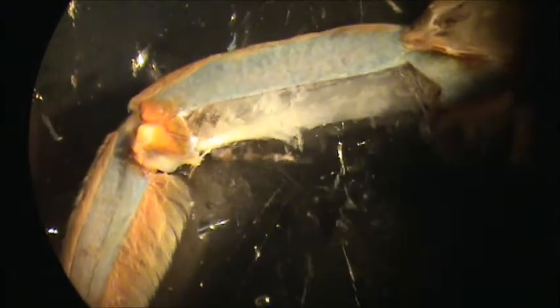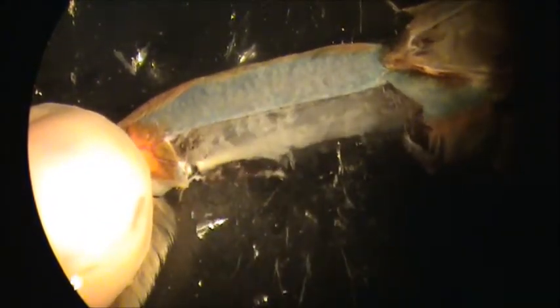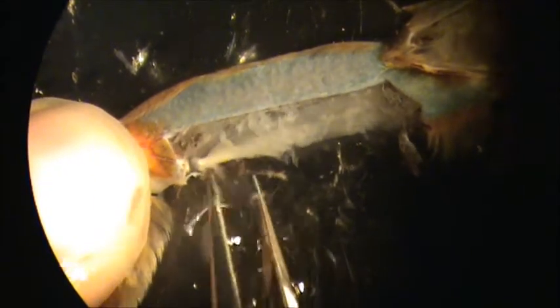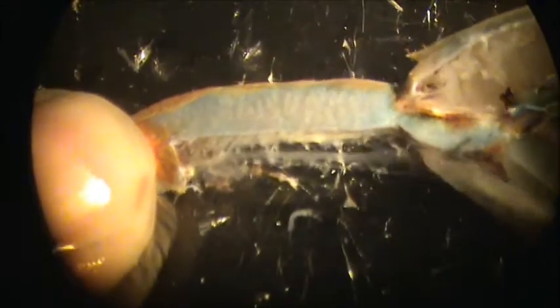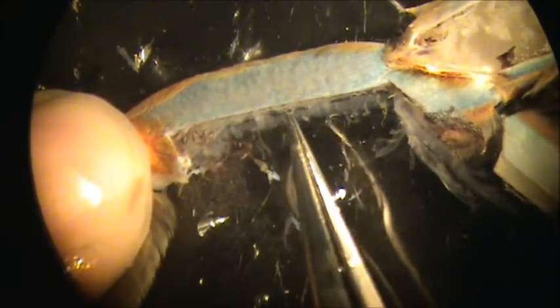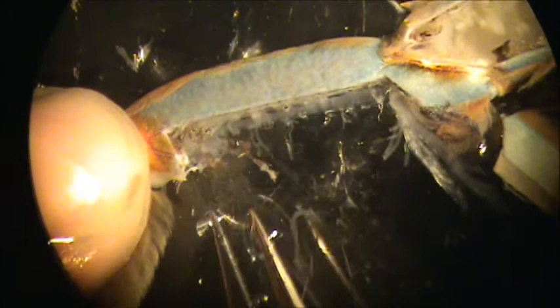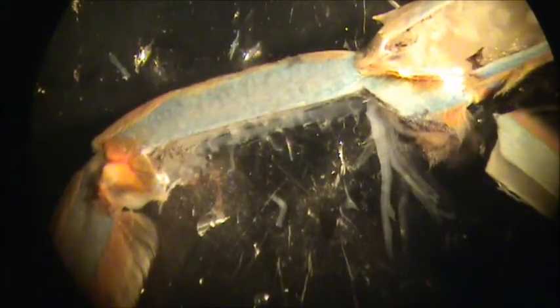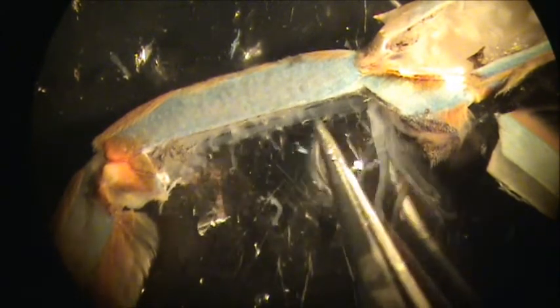Then now let's cut the tendon because we don't need it. And we can pull it back like this and remove it. Also, you can see this is a nerve bundle here. And also we don't need this nerve bundle because the tension nerve is located close to the motor neurons. If you remove this nerve bundle, it doesn't matter.